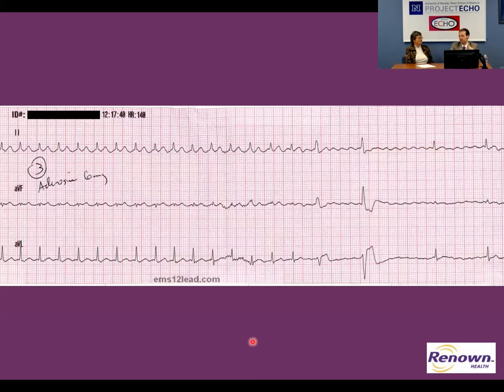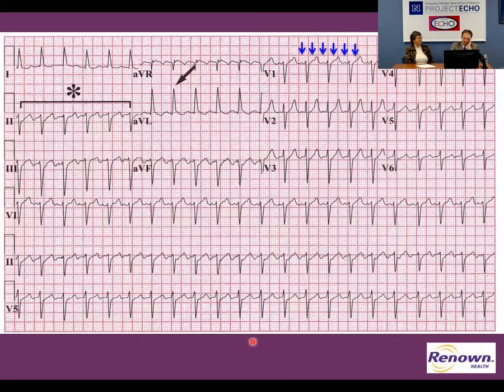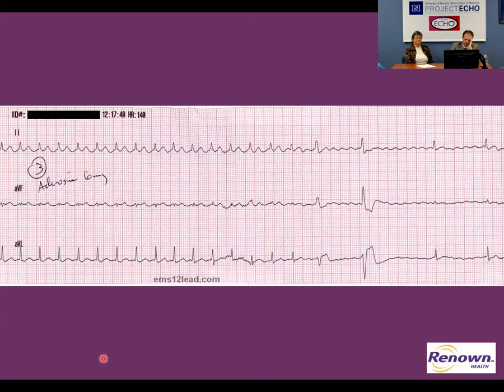And so this is actually a maneuver that cardiologists will do not uncommonly to figure out if that flutter wave is a classic sawtoothy flutter wave like we're seeing here. From the previous EKG, just to go back a second, this is not a sawtoothy flutter wave. It's a flutter wave, but this is more like a left-sided atrial flutter, and this is more like a right-sided atrial flutter, a typical atrial flutter. So I'll go through the anatomy of a typical atrial flutter similarly. But this is what you would expect to see with adenosine and atrial flutter.